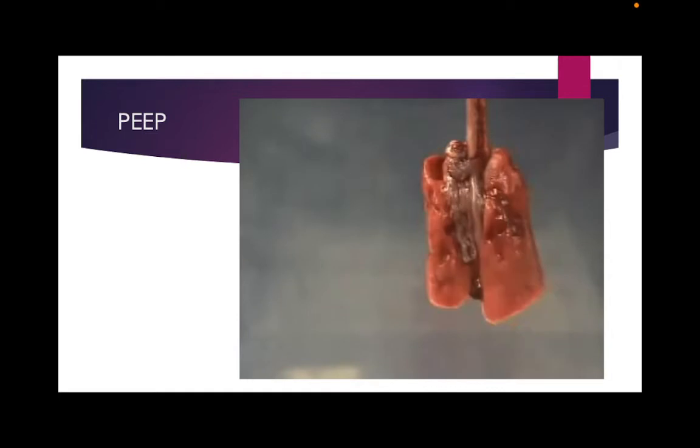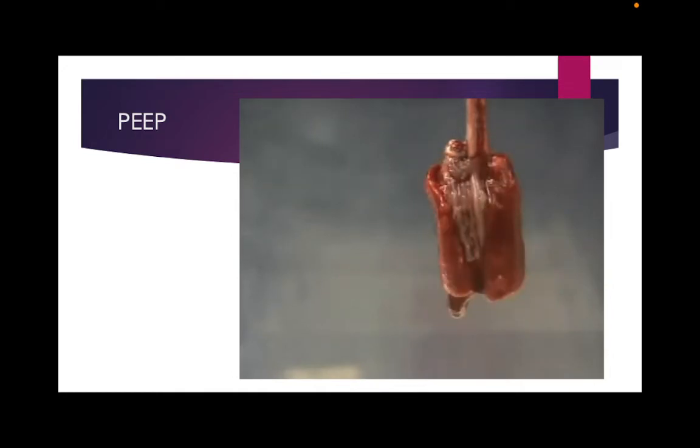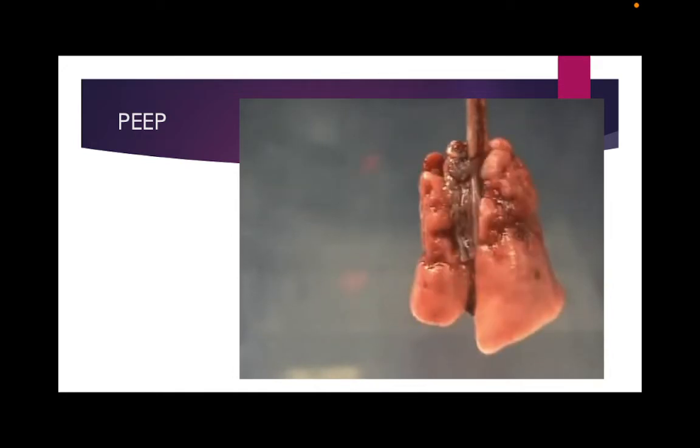Right, so you have increased intrathoracic pressures, which does what to your venous return? Reduces, which does what to your blood pressure? Decreases, okay? So as you're increasing your PEEP, keep an eye on your blood pressure, okay? If your blood pressure drops, what do we do? Do we take it back and then let your patient be hypoxic? You're playing a game, right?